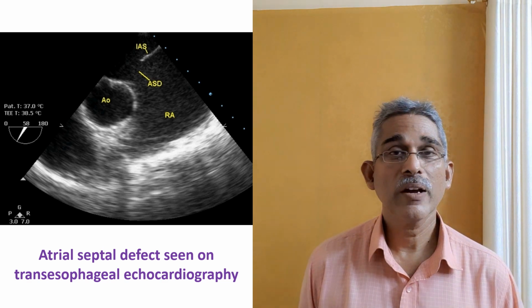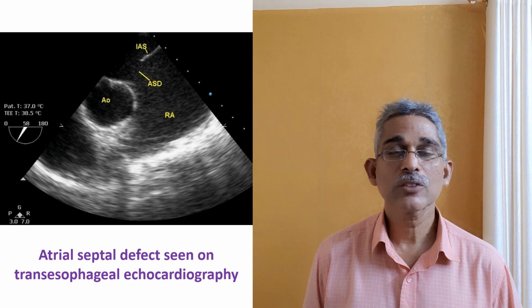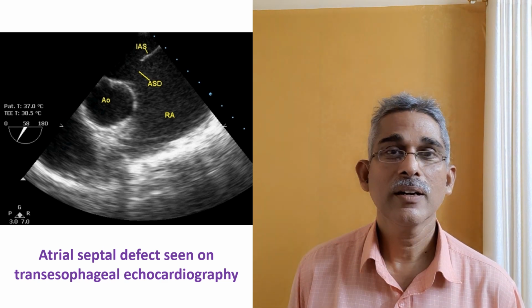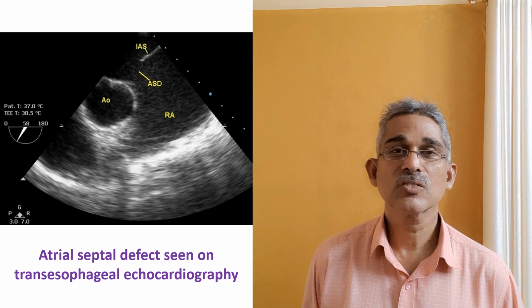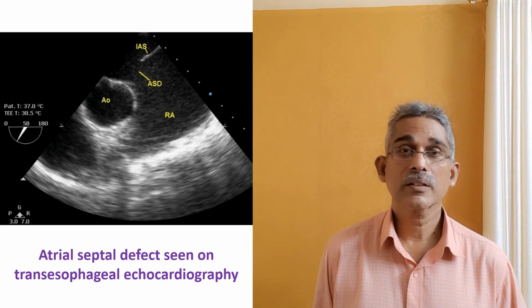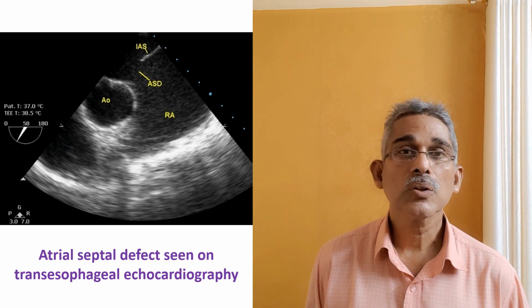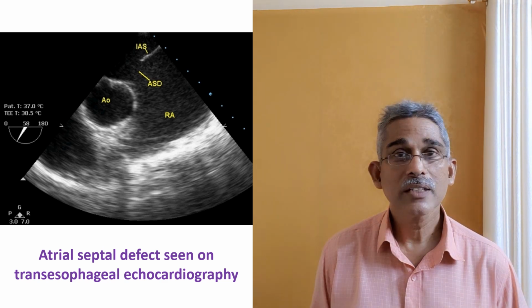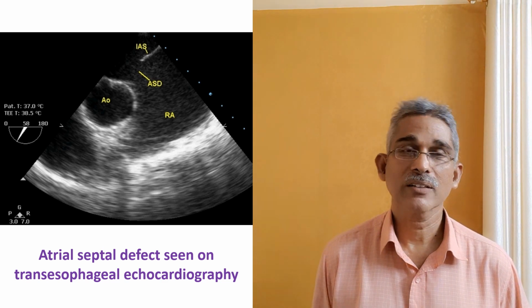For monitoring of left ventricular function during non-cardiac surgery, transesophageal echocardiography is an important method, and nowadays most advanced anesthesiologists use transesophageal echocardiography even for non-cardiac surgery to monitor the function of the heart, just as you have ECG and other parameter monitors during anesthesia.